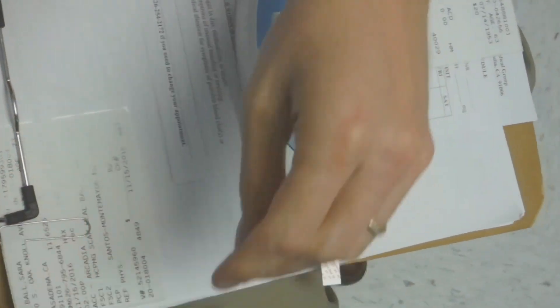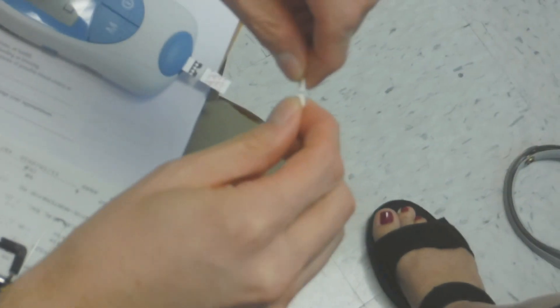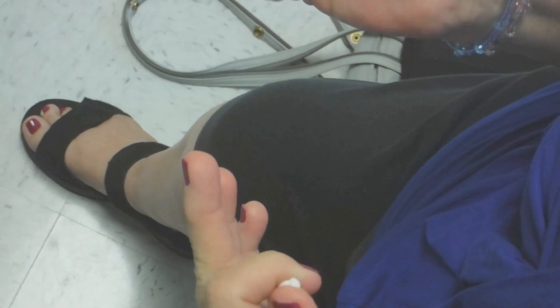And what is this? You twist it? You just twist it and then you have a point? Yes. Oh, okay, I gotcha. So then you twist it, poke the finger, and then it's supposed to bleed, right? Oh, there it is.